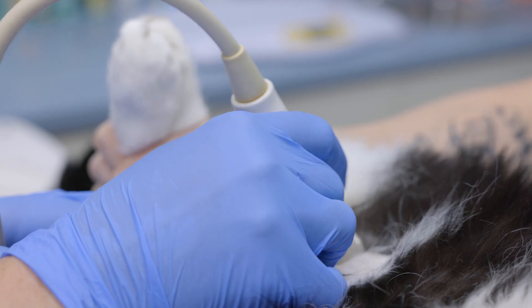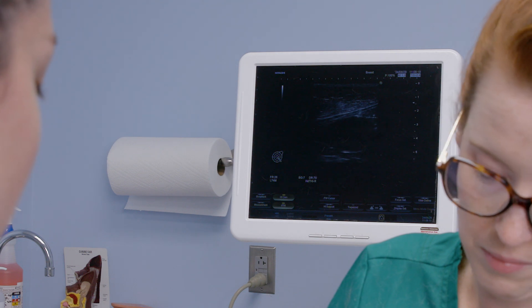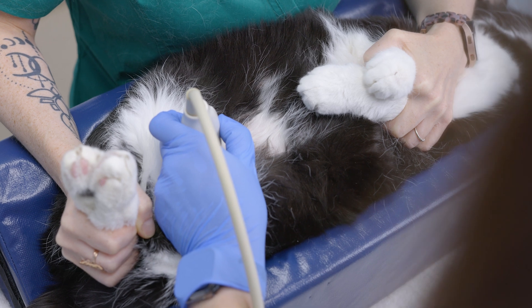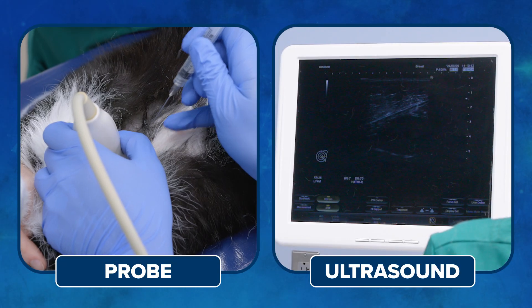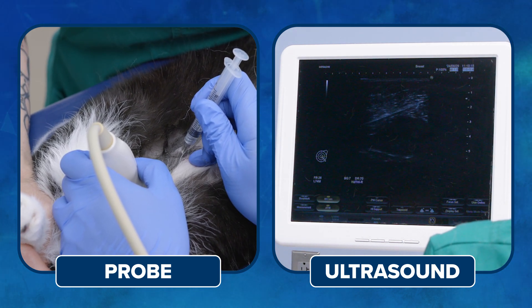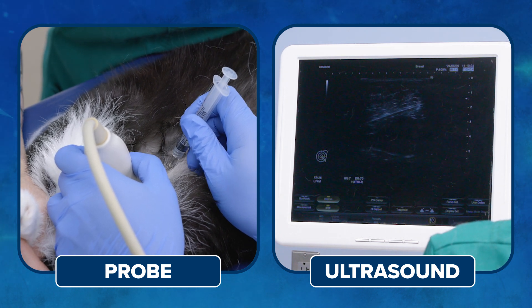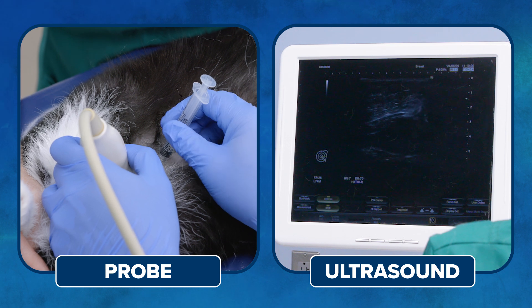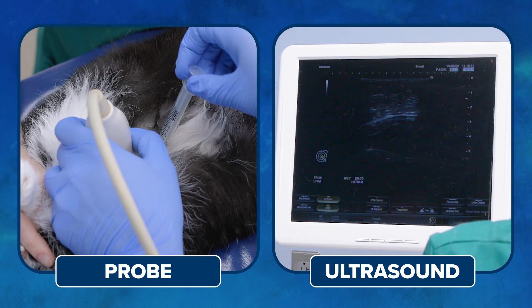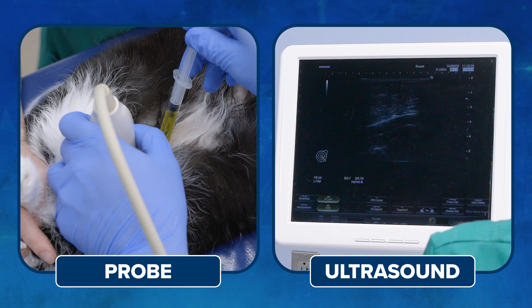Once we have our bladder in view — as you can see on the screen, the dark area is where the urine is inside the bladder — we go ahead and get our syringe and take the cap off the needle. We'll place the needle at about 45 degrees from where our probe is, then advance while watching the monitor to see the needle go into the bladder through the wall, and then pull back the urine coming directly from the bladder.